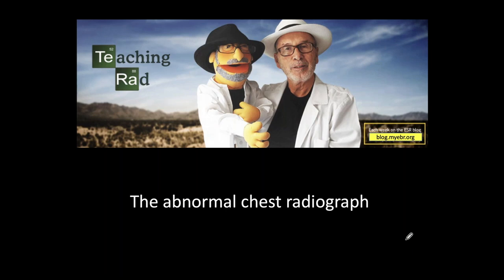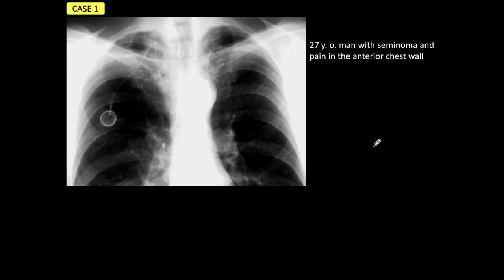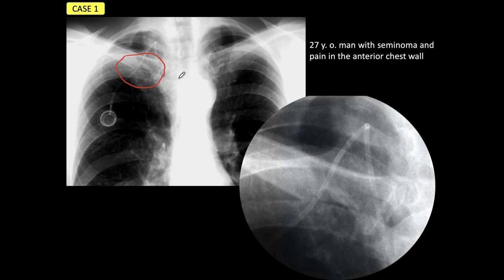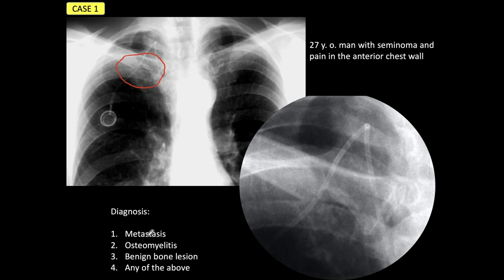Let's go to case number one. This is a coned-down radiograph of the upper chest in a 27-year-old man with seminoma who has pain in the anterior chest wall. I think you see the lytic lesion in the proximal right clavicle. I'll give you a coned-down view so you can see it better. I'm offering you four diagnoses: is this a metastasis, or an infection — osteomyelitis?